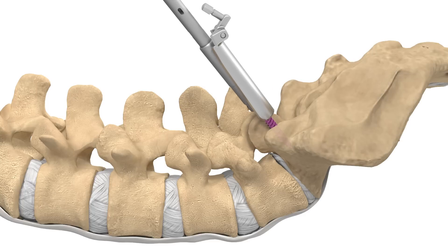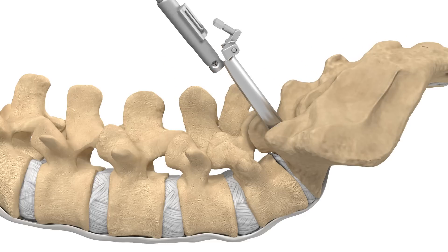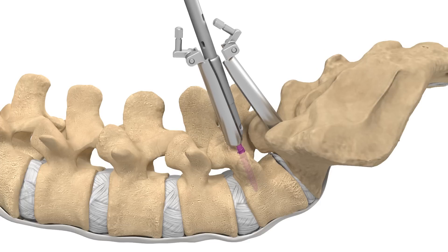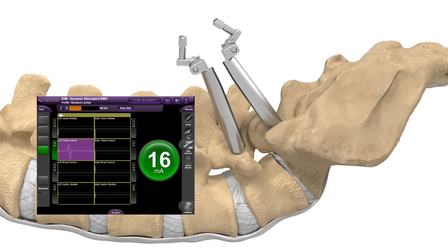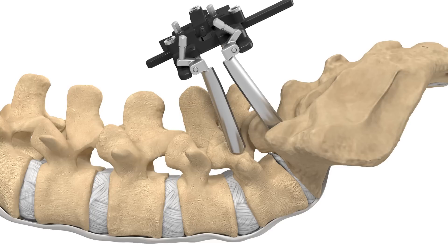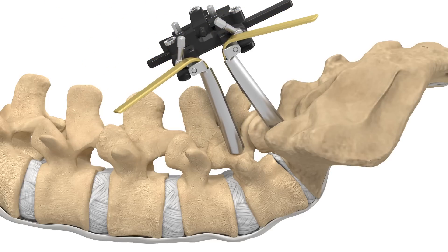Your surgeon will then place screws, which are connected to retractor blades, into the vertebrae that will be utilized at the end of the procedure to provide fixation. Nerve monitoring can be used to monitor disturbances to nerves during spinal procedures. A retractor will then be attached to the retractor blades, which have been designed to provide your surgeon direct access to the affected area.